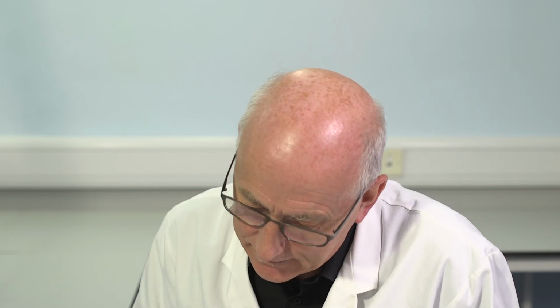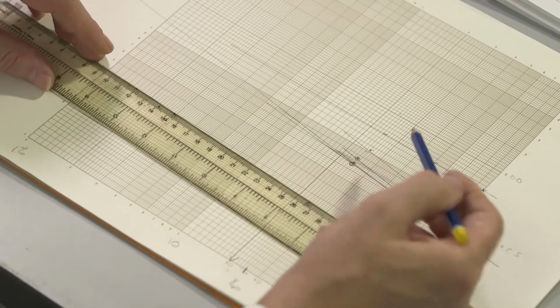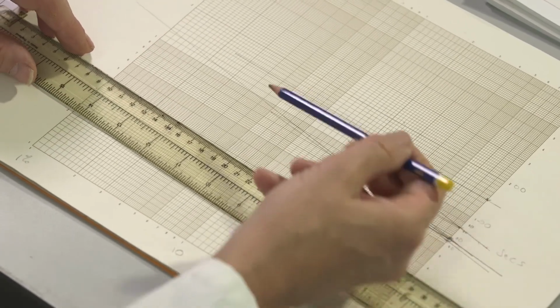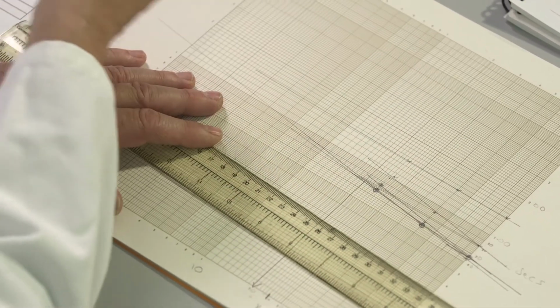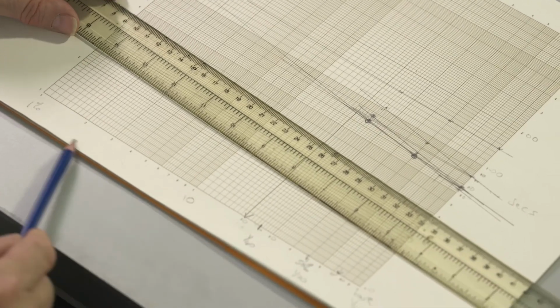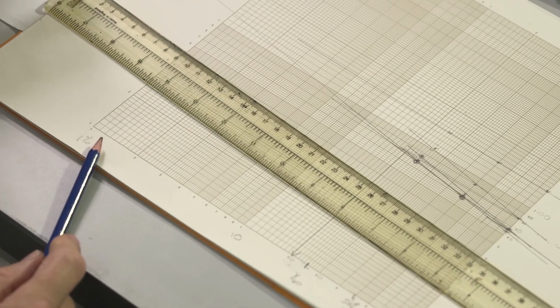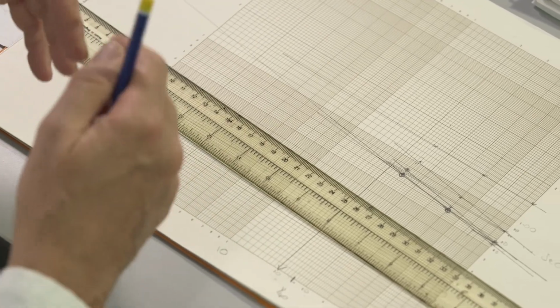But if we look again at the calibration curve, if this were extrapolated, and in particular if we had those additional dilutions to confirm the linearity, sometimes it's not present, but it may be, then we can see that the clotting time here would disappear off scale in this opposite direction. And remember, 100%, 10%, 1%. It will intersect the axis substantially below the 1% point. So from putting all that information together, the level of factor VIII in this sample is less than 1 international unit per deciliter.